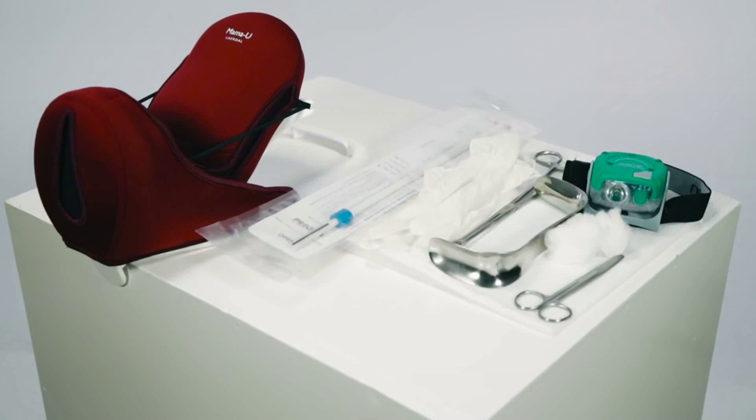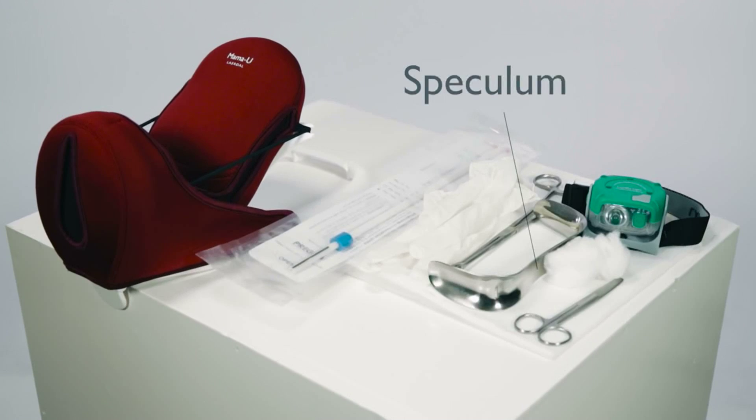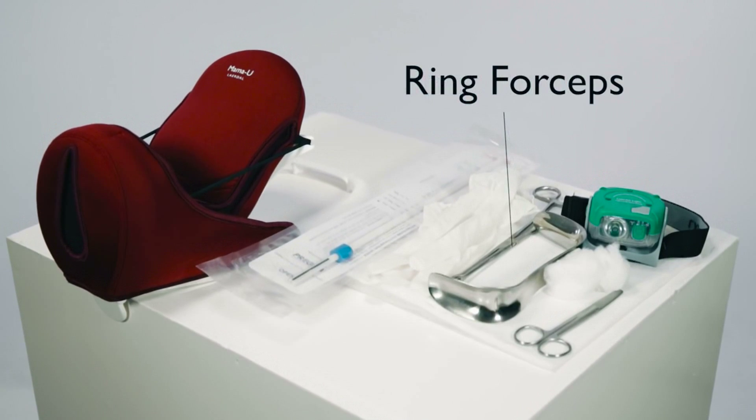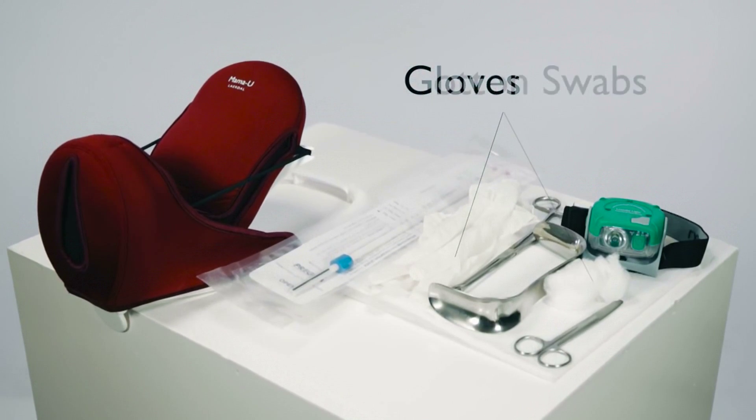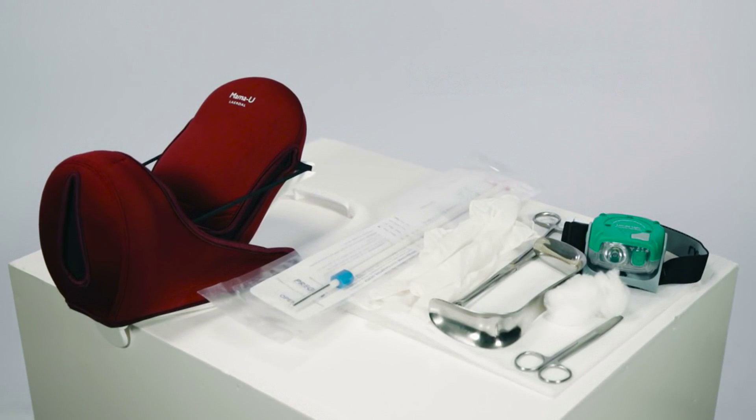To use Mama You with the PP-IUD long inserter, you will need a speculum, ring forceps, gloves, cotton swabs, scissors, and a reliable light source such as the Lairdall light.